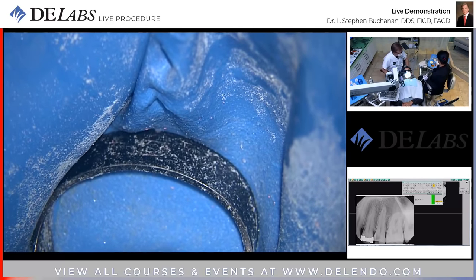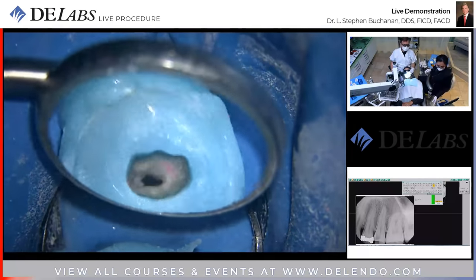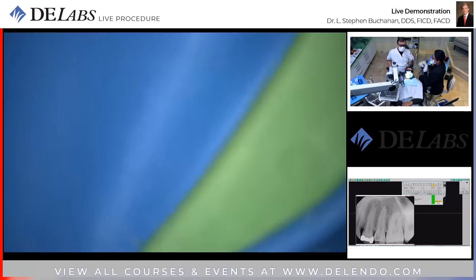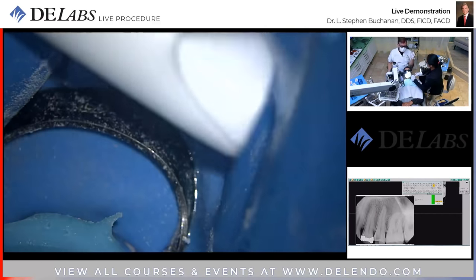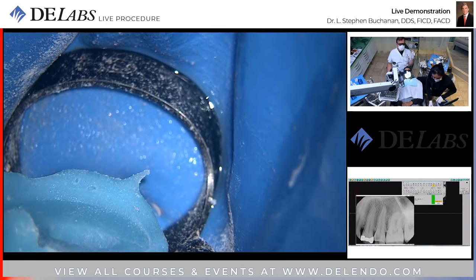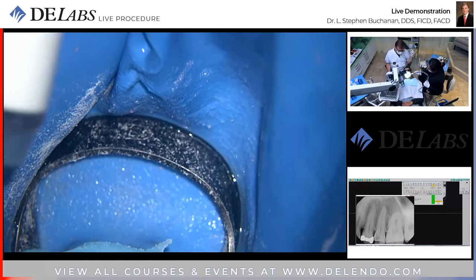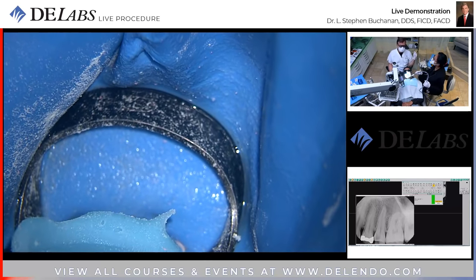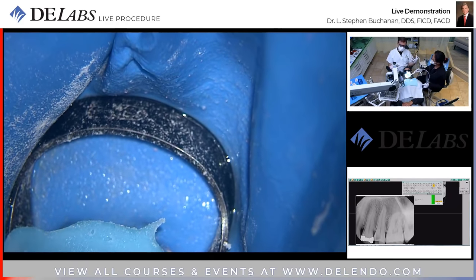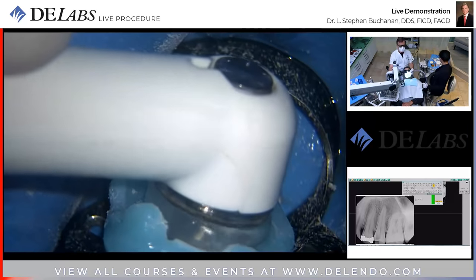So is it necessary to negotiate the canals? We have a question: negotiate the canals before gentle wave. Yes, it is. There are differing approaches to how much instrumentation you're going to do before and after gentle wave. It's really trippy to stay a millimeter short and find out what the shape is without even touching it. Sometimes I do that, and then after the gentle wave, I can stop in the middle of the EDTA cycle, do a little gauging. If I have to make a little tiny cut there, then that's a good time to make it, and then I put the instrument back on, and I'm finishing up by removing that last little smear layer that I created by finishing the prep.